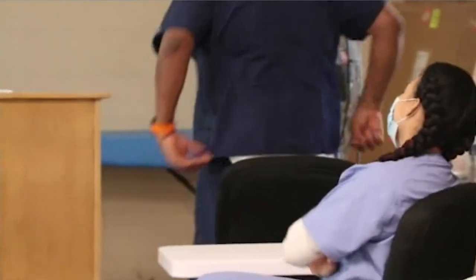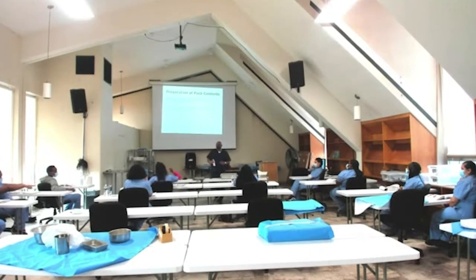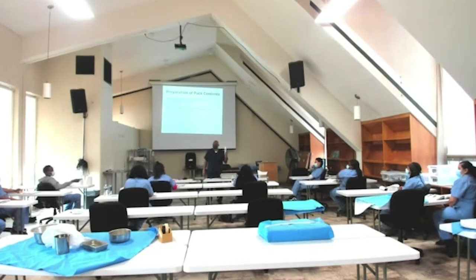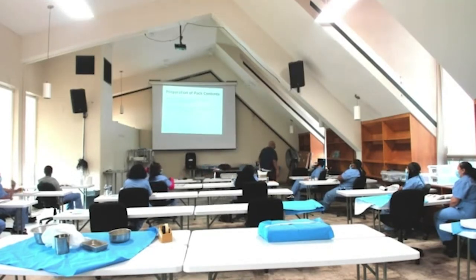Okay. Lubricant. What's another word for it? Where do we use it? Over here, over here, or over here? Over here. You're not decon. Where do we use it, guys? Lubricant. Assembly. You guys are testing the functionality. All they gotta do is clean them and push them through. You guys are the ones that use it. Okay, good stuff. So we apply the lubricant as necessary.